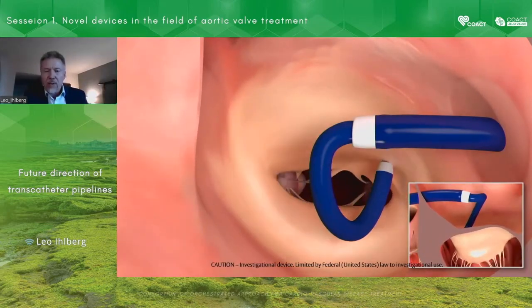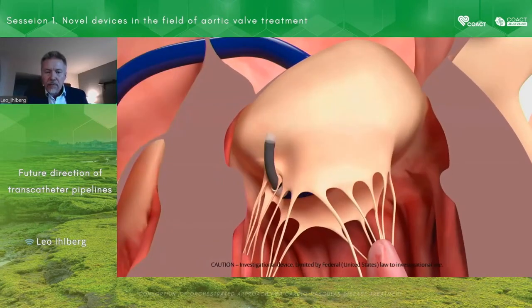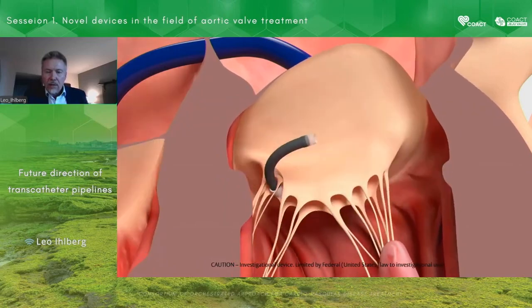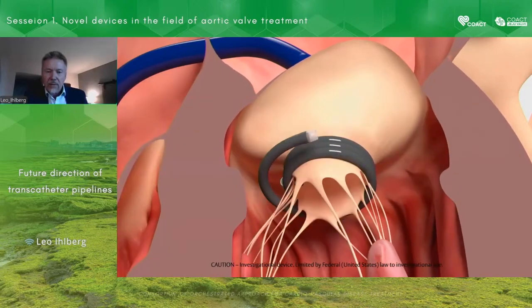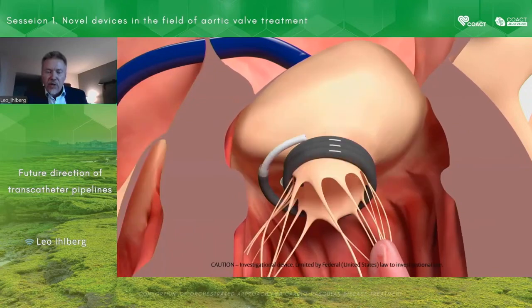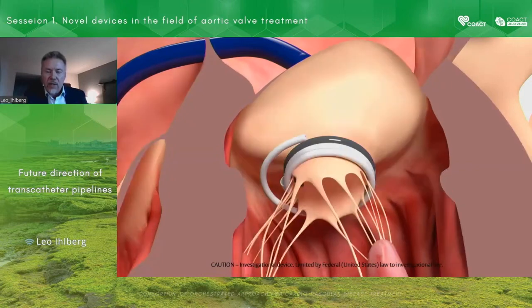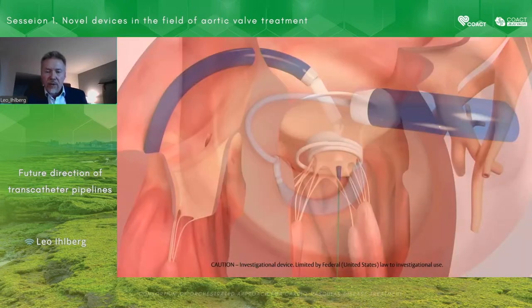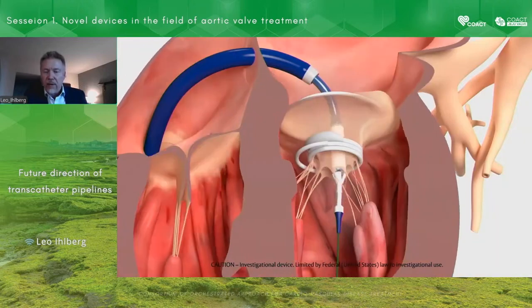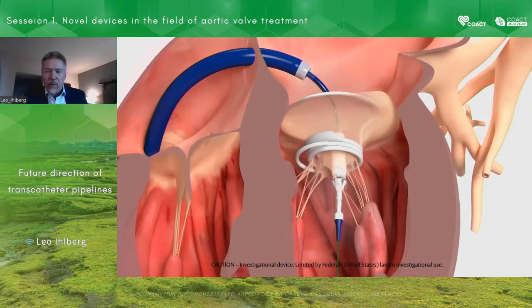Then it's going to be circumnavigating under the valve, as shown in here, making a couple of loops around the valve, and thereafter it's unsheathed and released, leaving portions of it sitting on the atrial side of the valve, as shown in here. And that will be the docking station, whereafter the actual implantation of a SAPIEN valve in a normal balloon-expandable fashion is a pretty straightforward procedure.